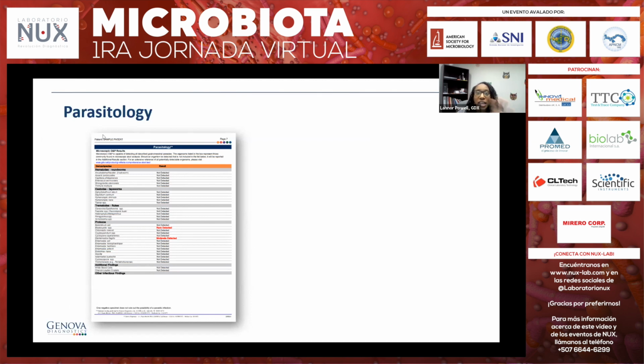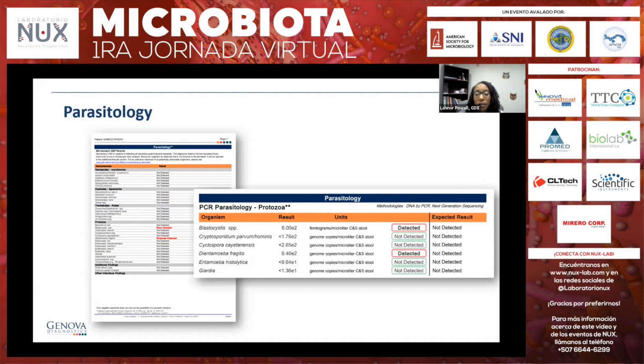And then on the 3rd day, they'll do the mass collection of all the other tubes. But that way we're able to identify on separate days, do we have any parasites in those stool samples, which helps to increase our ability to recover anything if present. So if it's not detected, we say not detected. If we find it, we quantify it as rare, few, moderate, and many. We also do PCR of these 6 parasitic targets, and we will say if it's detected or not detected.